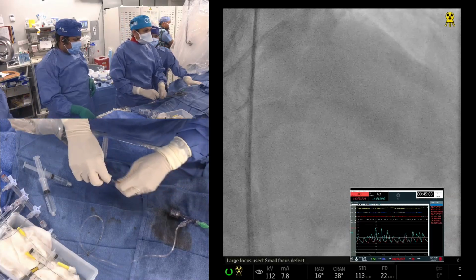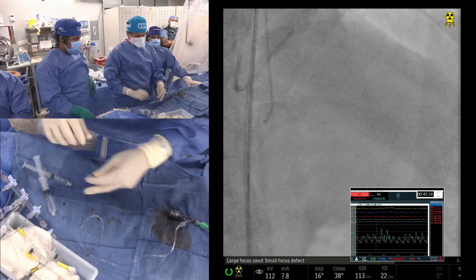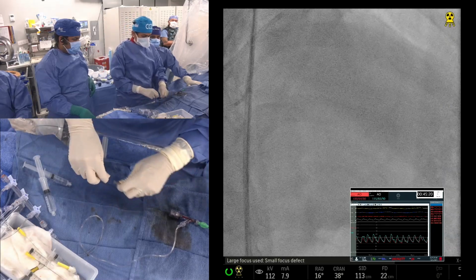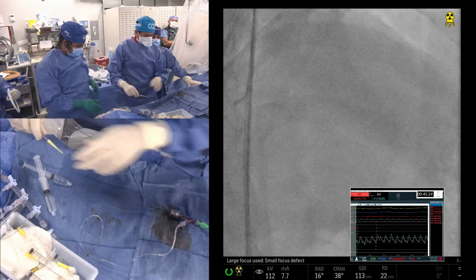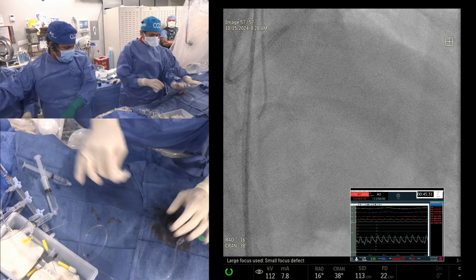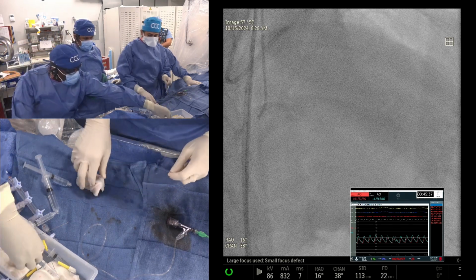So we're going with the 2020 compliant balloon. Any questions there? Not so far. I think people are just concentrating, and a few may have even gone and opened the guide wire. Can you ask him the hemodynamic should come here? We cannot see that. My other observation is that most people start joining in the middle of the case, a little later.